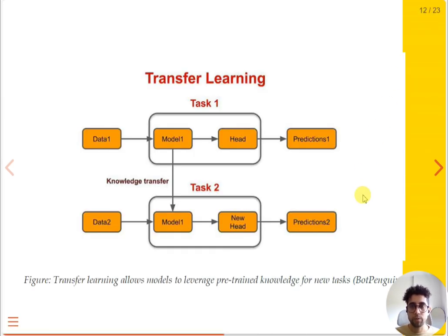This diagram shows our transfer learning approach. We train a 7-channel base model on the SC data, freeze its weights, and add a projection layer to map 5-channel ST inputs into the same feature space. We then fine-tune the head layer on the ST data.